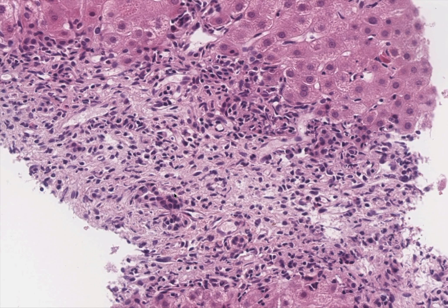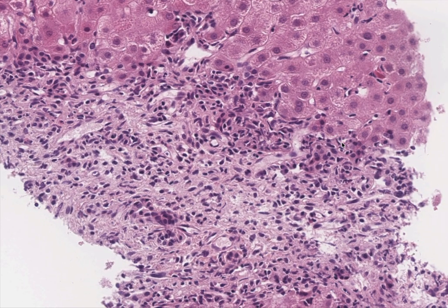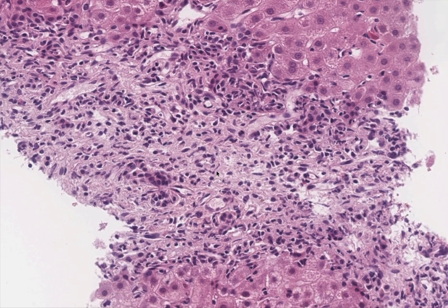So in this portal tract we can see that there is interface hepatitis. We've got this irregular infiltration of lymphocytes into the plate here, and hepatocyte death replaced by fibrosis. We've also got some bile ductular proliferation.